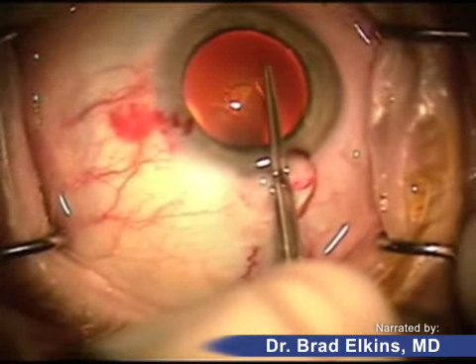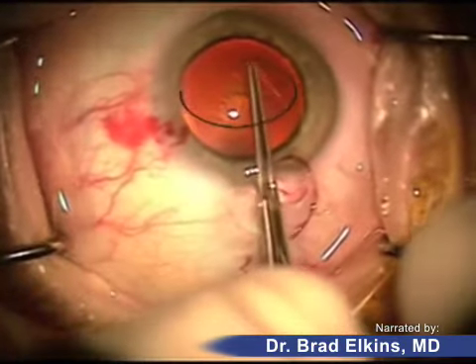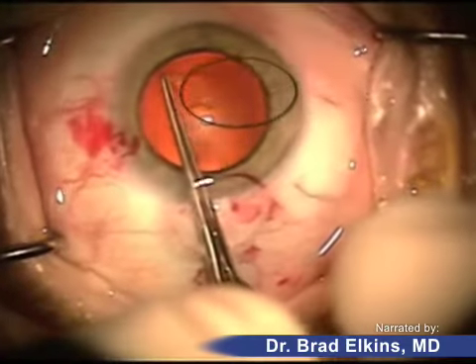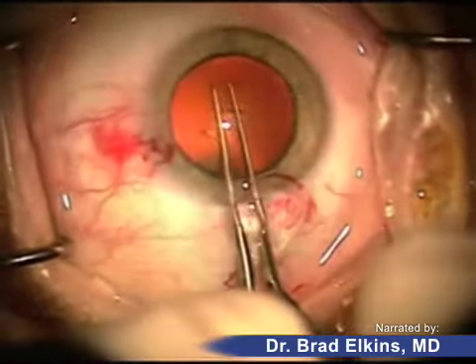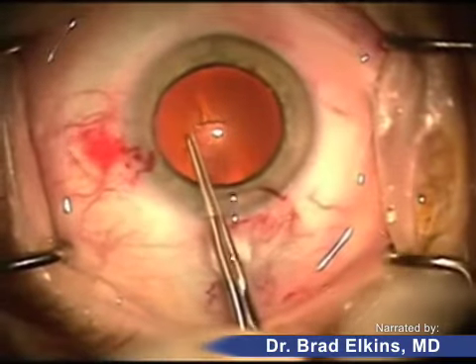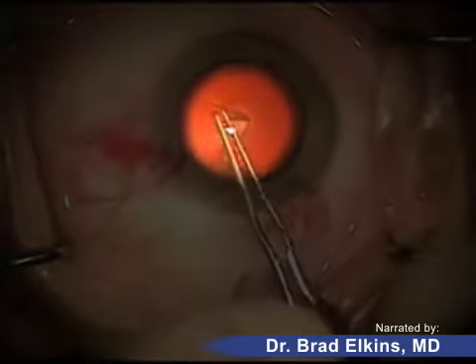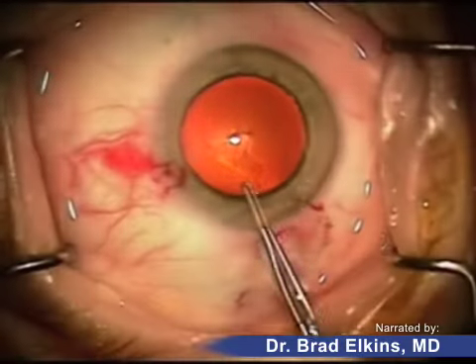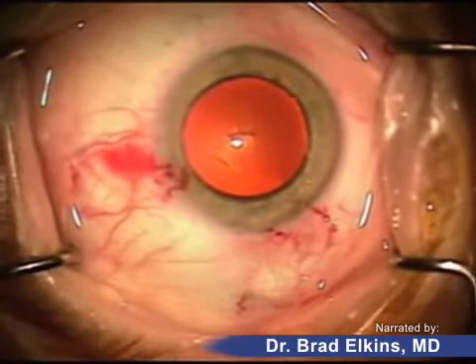The goal here is to give ourselves access to this lens structure, which is quite large and thick, sitting inside the eye. This whole structure is the lens and it's very thick. What we're doing, as you can see it being peeled back, is creating this circular opening within the front part of the lens so that another instrument can go inside and remove the contents of it.